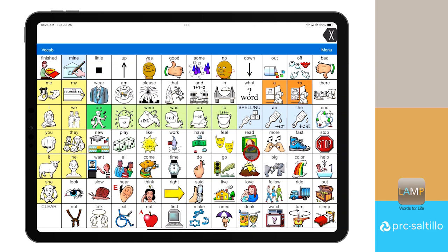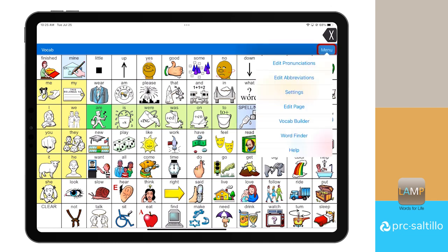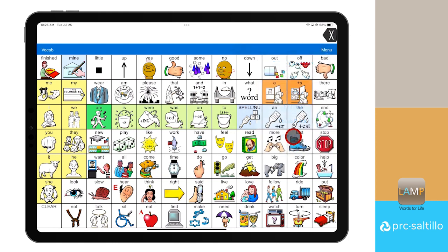Another way to get to WordFinder within Lamp Words for Life is through the menu. To get to WordFinder this way, select menu in the blue bar above the vocabulary, then select WordFinder.